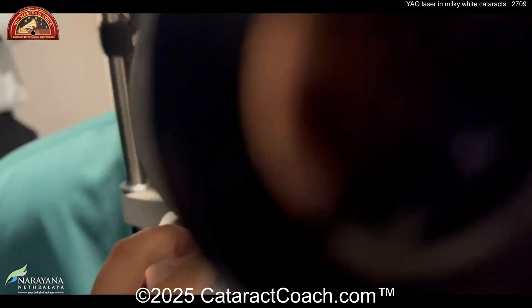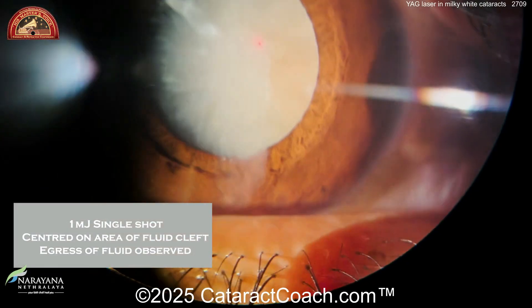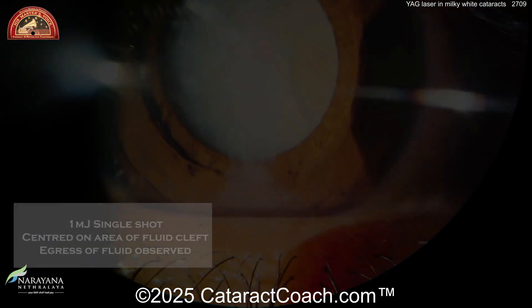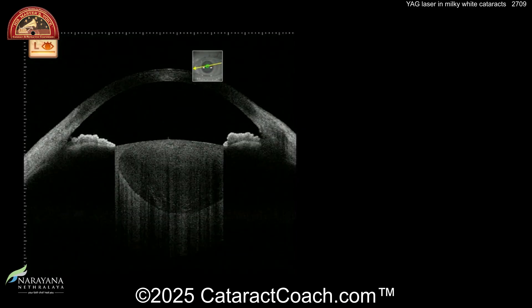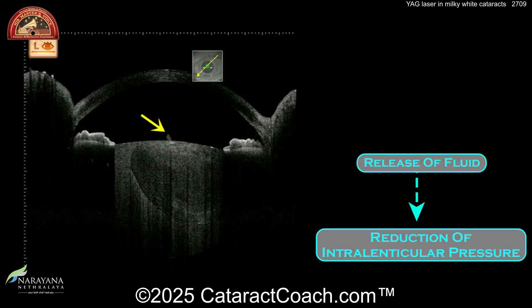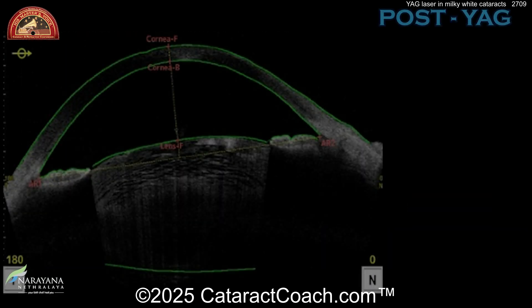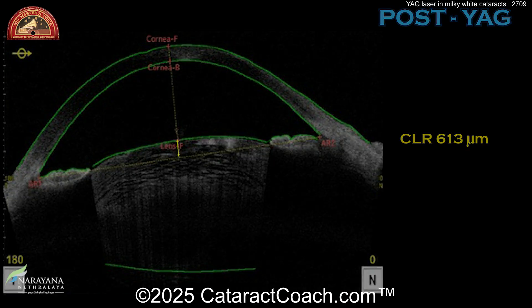Let's review the YAG again. You focus at one millijoule — just one shot — right in the center of the anterior lens capsule. Pre-op the CLR is 1263 microns. After the shot, you can see the fluid starts to leak out, you reduce that intralenticular pressure very easily, the anterior chamber deepens, and the CLR is now half of what it was: 630 microns. Amazing.